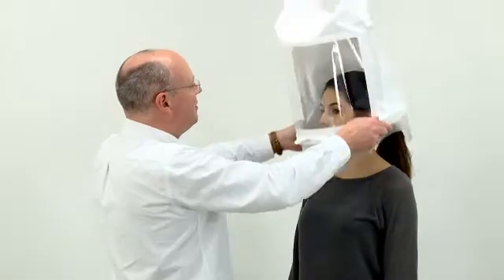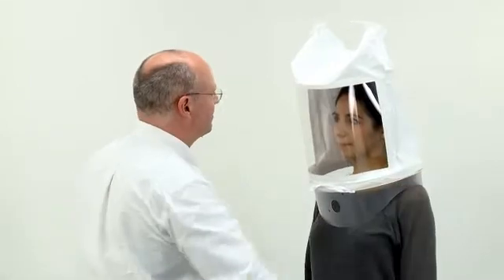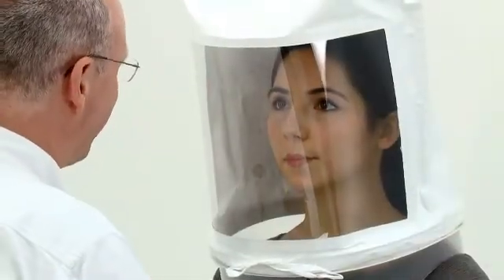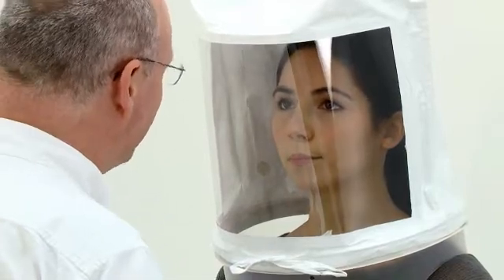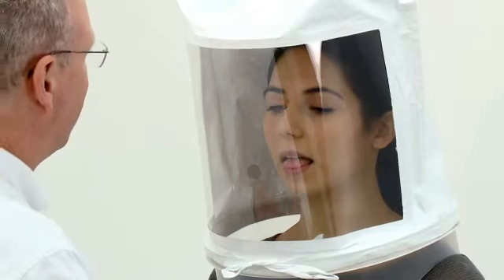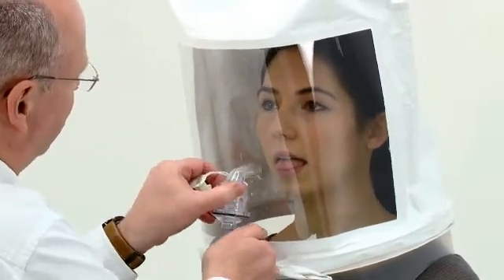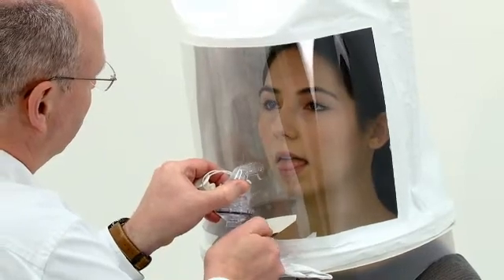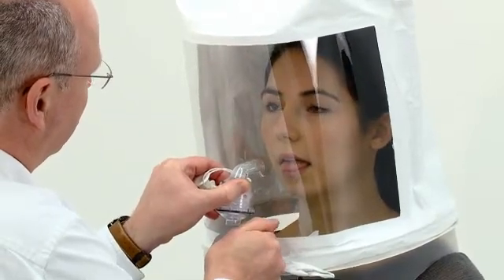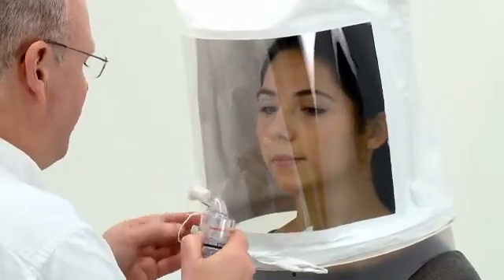Fit the hood without a respirator fitted and arrange the hood so that there is a gap of approximately 15 centimetres between the front of the hood and the subject's face. Ask the subject to breathe through their mouth with their tongue slightly out and to indicate when they taste the solution. Place the Sensitivity Test Nebuliser into the hole in the front of the hood. Squeeze the bulb to inject the test solution, allowing the bulb to inflate fully between squeezes. Count and take note of the number of squeezes it takes for the wearer to taste the solution.